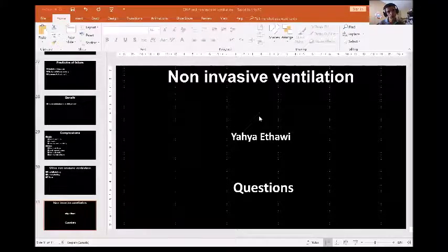Can CPAP mode in the ventilator be used by ETT only? We talked about it: CPAP from the ventilator is a continuous flow CPAP, so you can use it regardless of the interface. But with continuous flow, you cannot use a generator. So if there is no generator, you can use the CPAP derived from the ventilator with a mask, nasal prong, ETT, or nasopharyngeal tube.